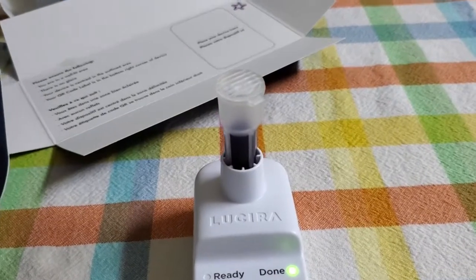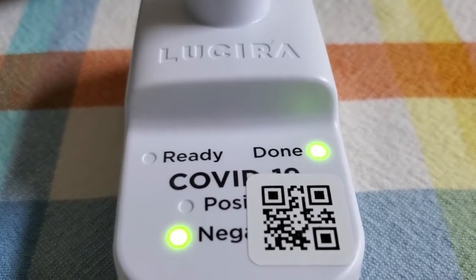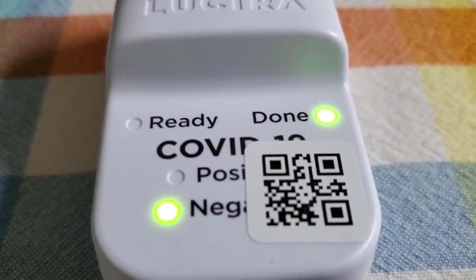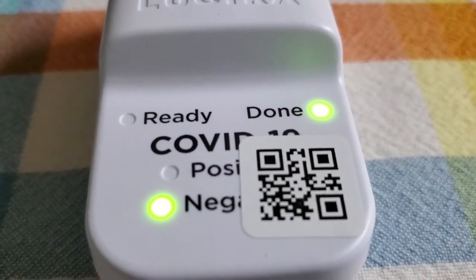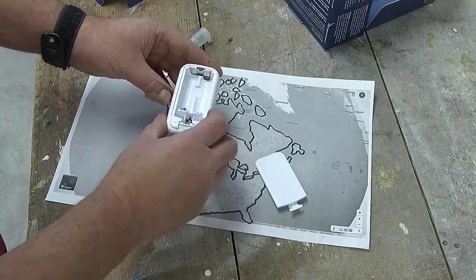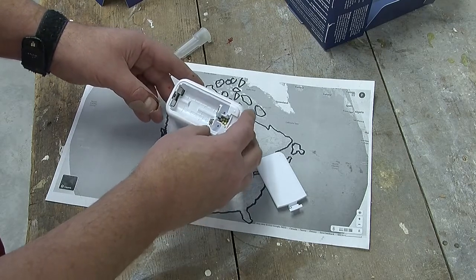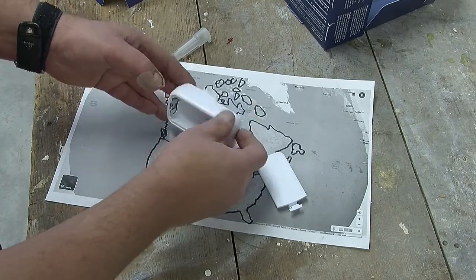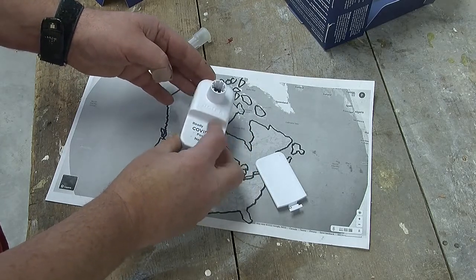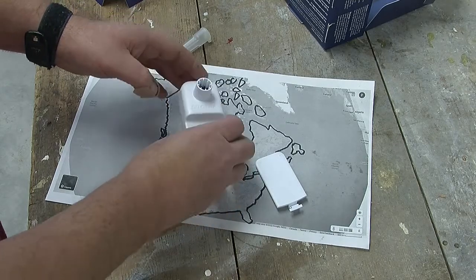I do have some video that I took after completing the test and showing the negative result, but what's really the point of today's video is we're going to take the whole thing apart and see exactly how it works. And the first thing to point out is it uses standard AA batteries, and I guess the first thing to do is let's put in some batteries and see if the test activates again, or if not, what sort of an error message it shows. So just hold on a sec while I get some batteries.